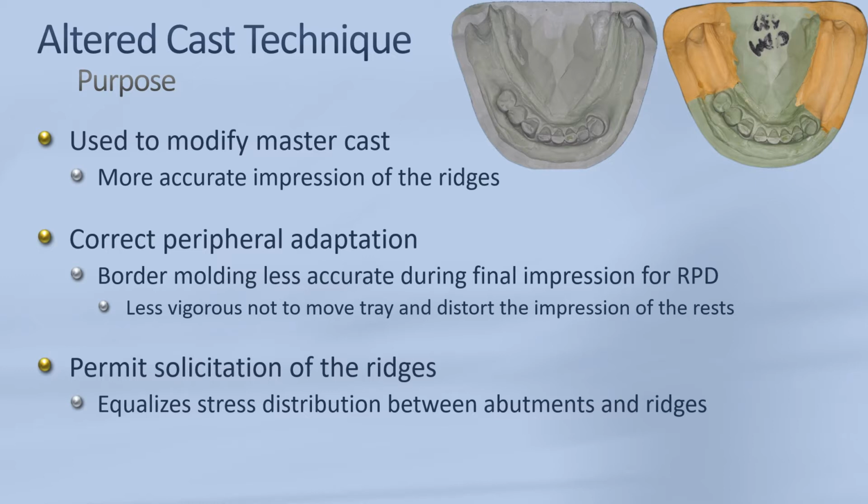One of the reasons might be if a final impression was not very precise in the posterior area or not properly border molded. We could correct the cast using that technique.